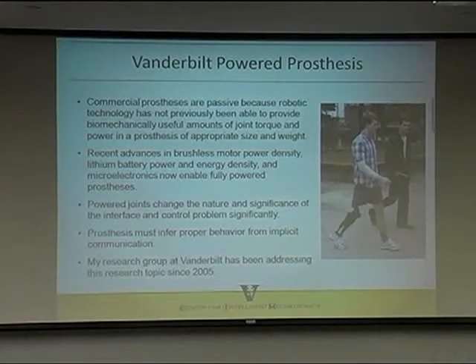The second issue is the control problem, in that before, you had these devices that are rigidly attached to you, and all they could do, the passive devices, is react to what you do to them. So they're very predictable and controllable. A leg that has its own power like this can decide to do its own thing and start moving itself. So I could be standing here, and it can decide that I want to start running and start flapping around, and that's obviously unsafe and awkward.